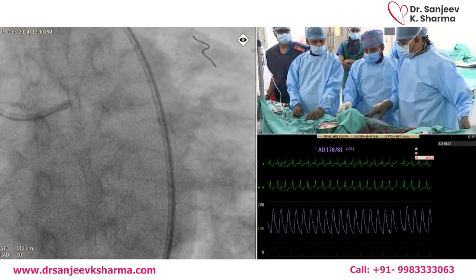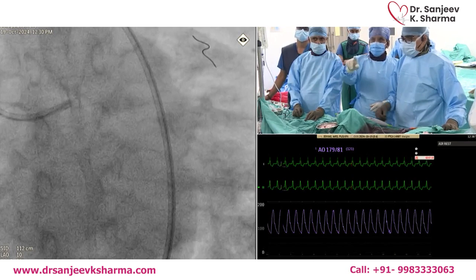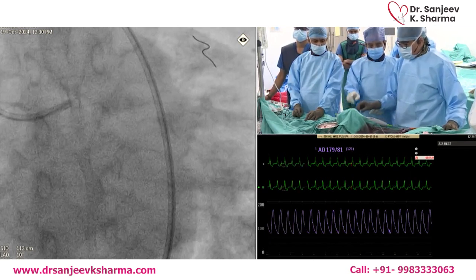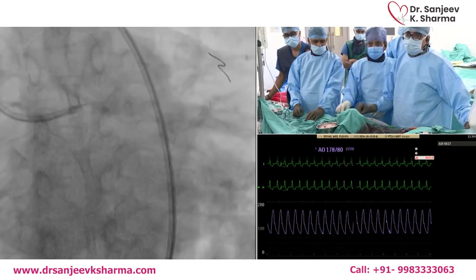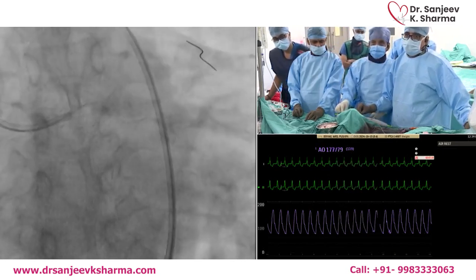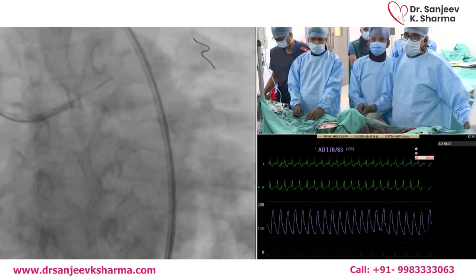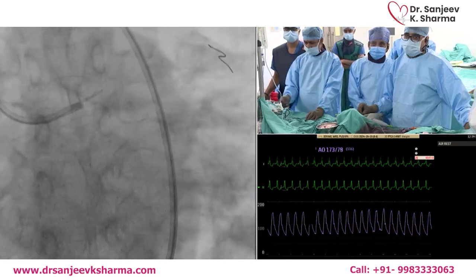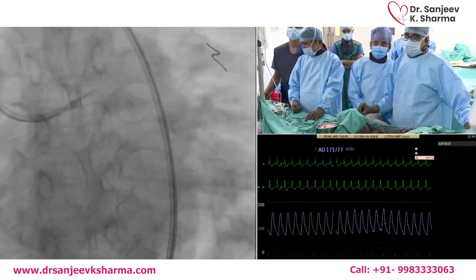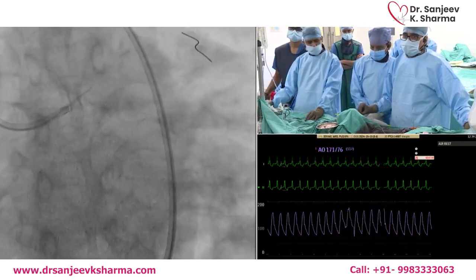Now, what we are going to do, as George suggested, is go over the 80 further and, coming back, go 120. Let's say we are going to do a 120 in this case, which is usual. There's no penalty for stopping and leaving this catheter distally. Unlike rotablator, where you have to return every time, you can just go and stay distally, let the vessel relax, and come back.